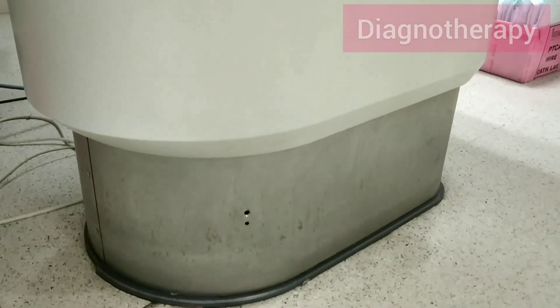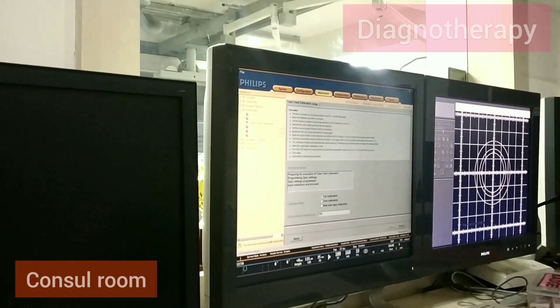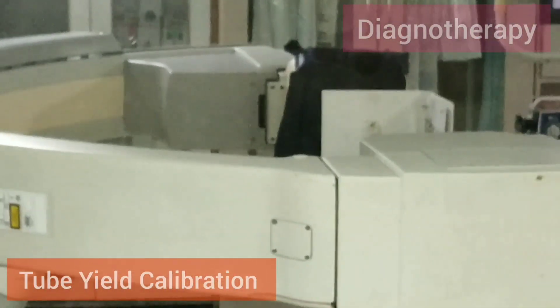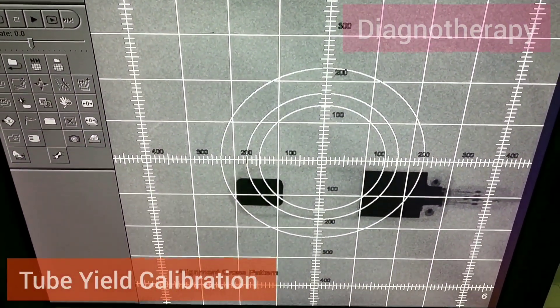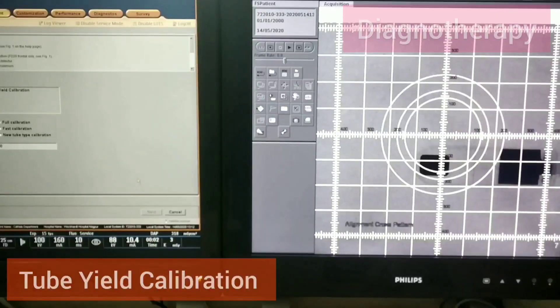Complete table inspection is done to check whether everything is right. Then we move to the console room where we put the machine in service mode. Then we start the tube yield calibration — we apply shielding on the detector and pass the X-rays, and in different quadrants we try to get the images.